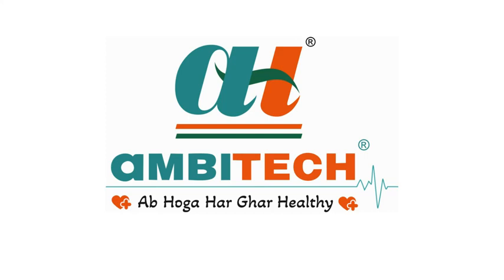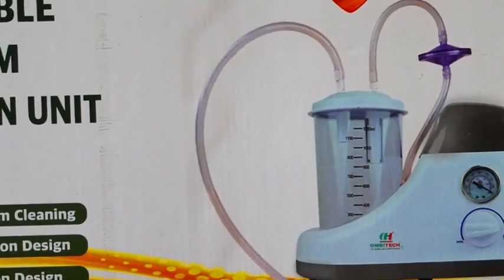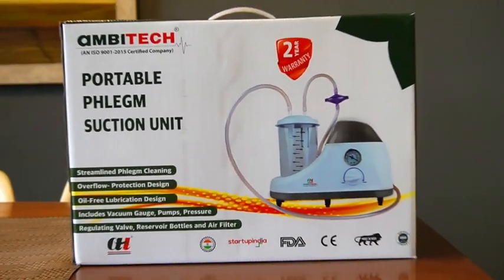Welcome to Ambitech, your home for innovative healthcare devices. Today, we're introducing the Ambitech Portable Phlegm Suction Unit, the Safe Mu Generation Oil-Free Suction Unit.